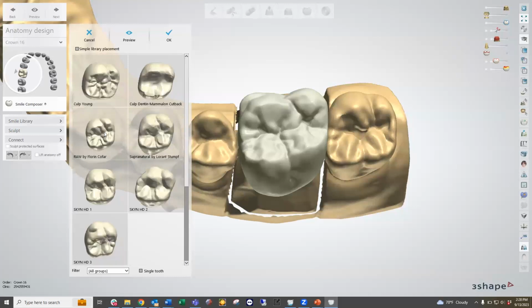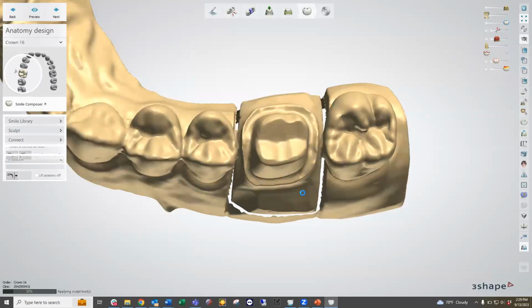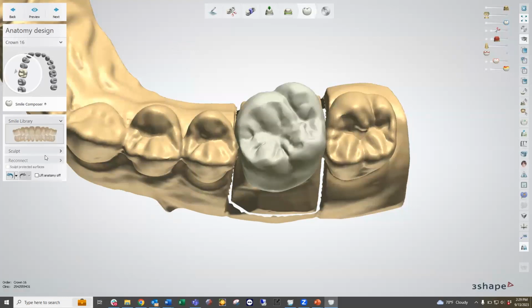Basically, select the crown you would like, and then it allows us to place this into its location. So I'm going to choose this library here. Typically, I don't like to design units with the cusp of Carabelli, so I'm going to use this option here. And now we can use our sculpting tools.